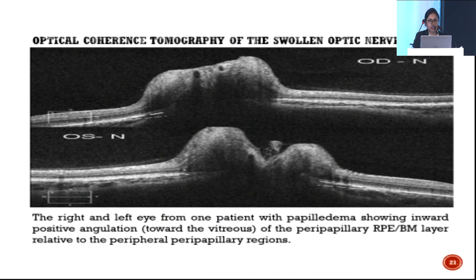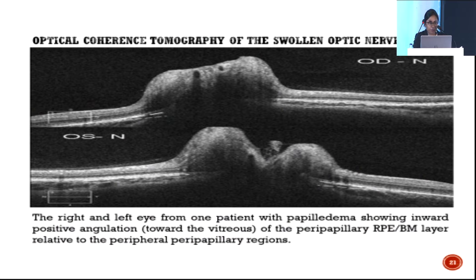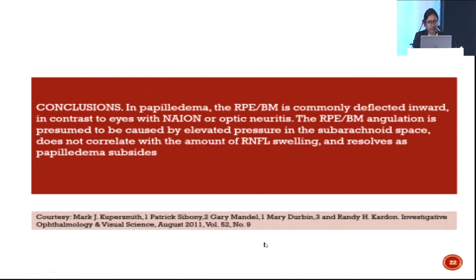The OCT of a swollen optic nerve head shows the RPE/Bruch's membrane line, which becomes deflected toward the vitreous in cases of papilledema, helping differentiate papilledema from optic disc drusen. Bruch's membrane angulation is presumed to be caused by elevated pressure in the subarachnoid space; it does not correlate with the amount of RNFL swelling and resolves as the papilledema subsides.